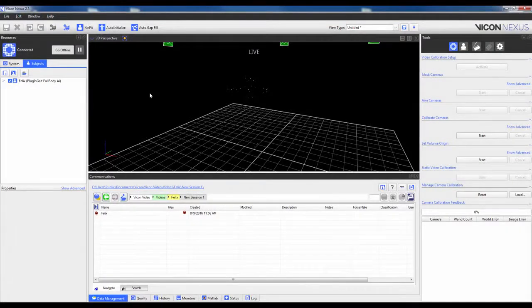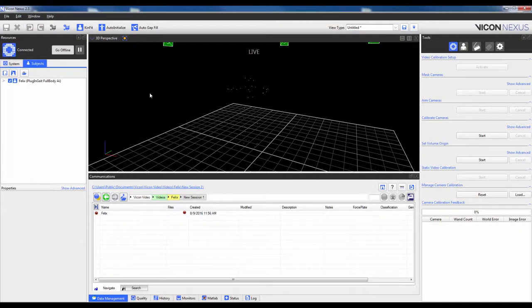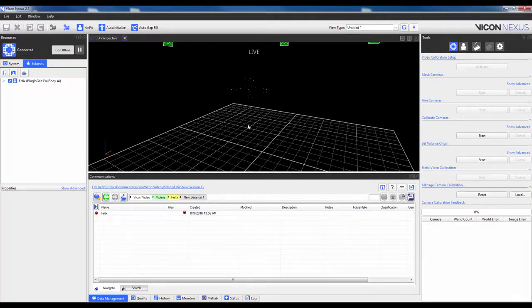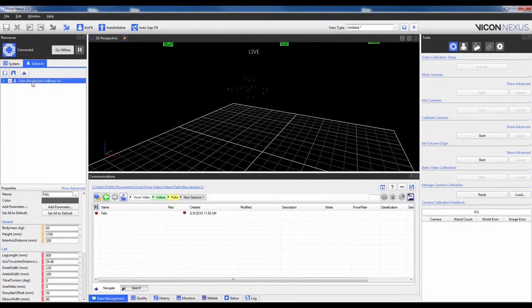In a previous guide, titled Plug-in-Gait Markers and Anthropometrics, the subject was prepared both in terms of placing markers on anatomical landmarks and entering in the required anthropometric measurements. Please be confident in these steps before proceeding.